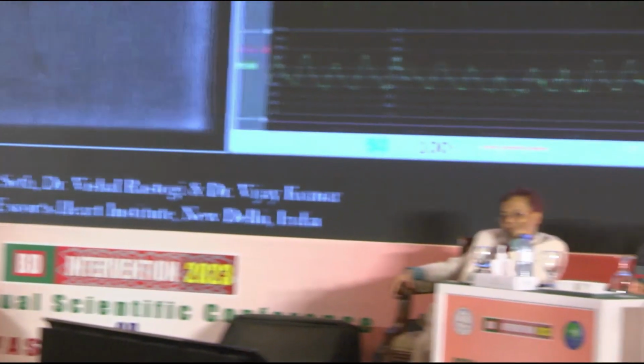Yeah, that's right. So, okay. Get me the 2 mm balloon. So what size balloon are you considering in this case? That wire is awkward. Okay. So it's a 2 mm non-compliant balloon to open up these two bifurcations. So what is the size of the balloon? 2 mm at the moment.